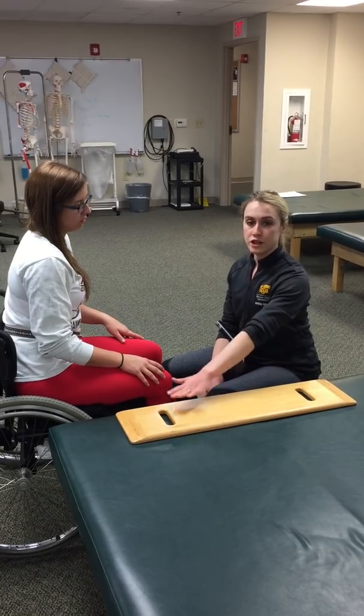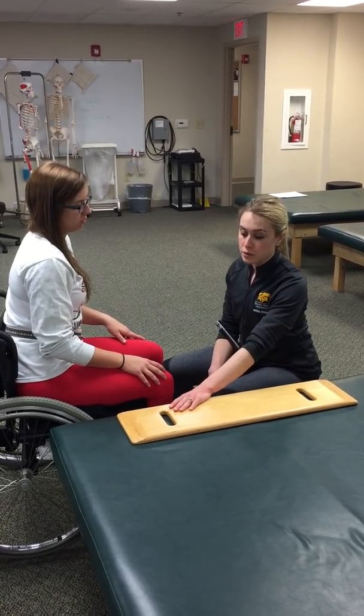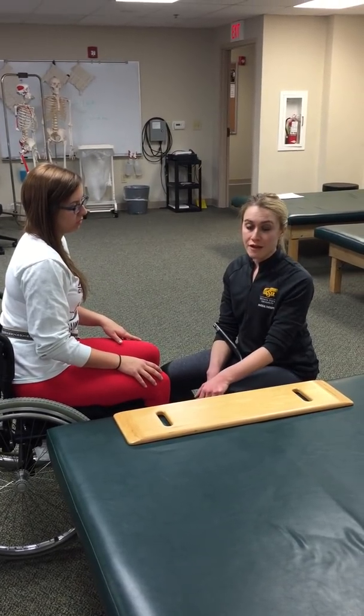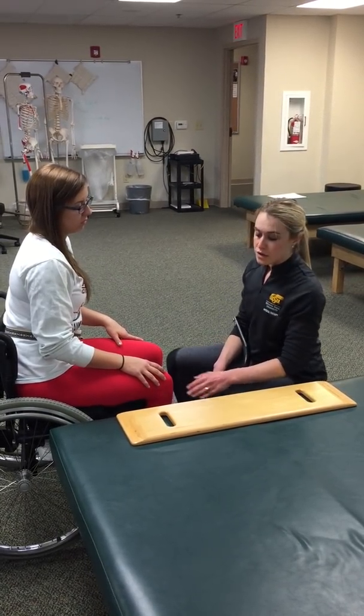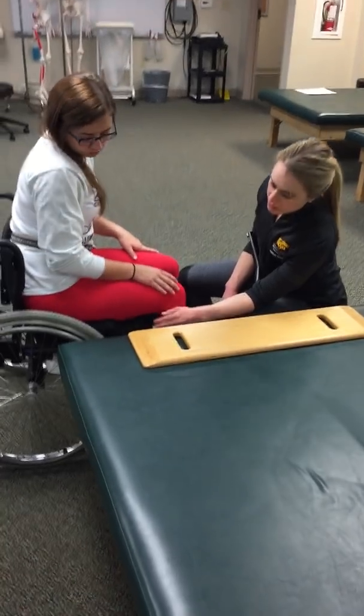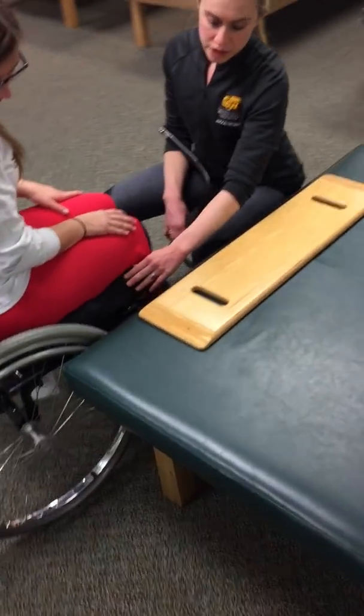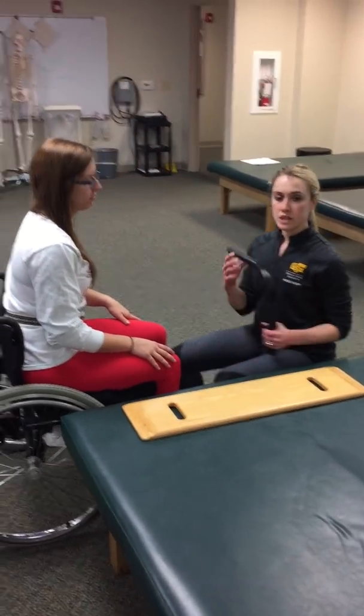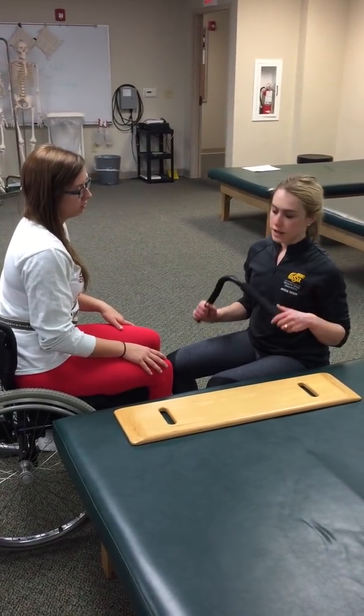Ideally, you do want your transfer surface, if you can pull it off, a little bit lower than where you're coming from, but that's not always something that you're going to have the luxury of controlling. So in this case, our height surfaces are relatively similar. Claire's seat cushion here is almost at the same level as the mat table. And what I've done here is I've removed her armrest to her wheelchair.